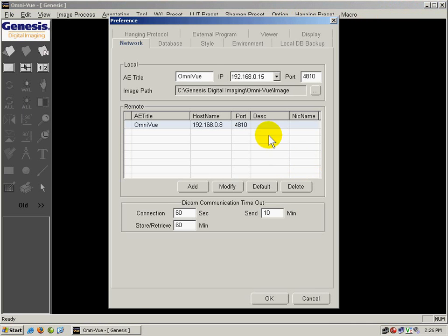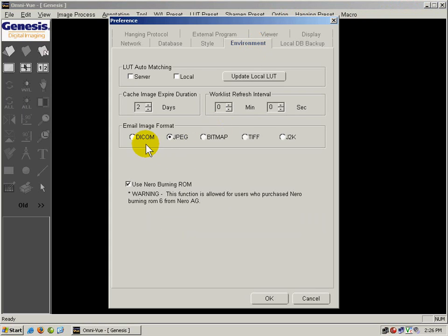From the preference screen, we will click on Environment and select the image format that we would like to email. For this example, I will send the JPEG image.